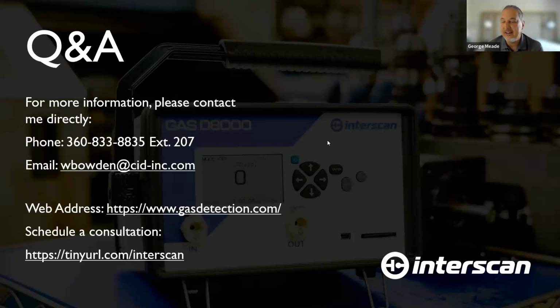So if there was cleaning done, if there was vapor done, I just had a customer in North Carolina where they do their monthly generator test, and they had to lubricate the generator, and the generator shared a wall with the ETO room. It was a solvent-based lubricant, and that got into the ETO room and of course was picked up by the monitor, and so it went off in the middle of the night.